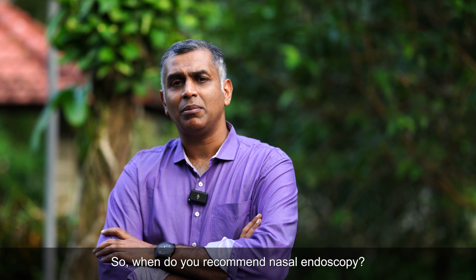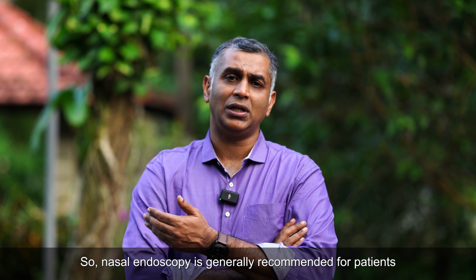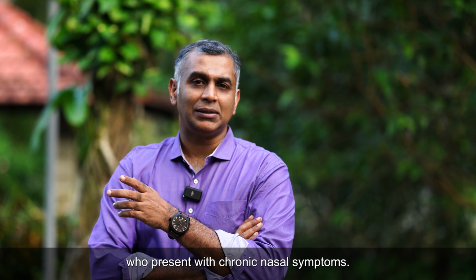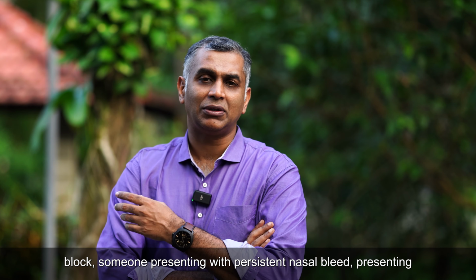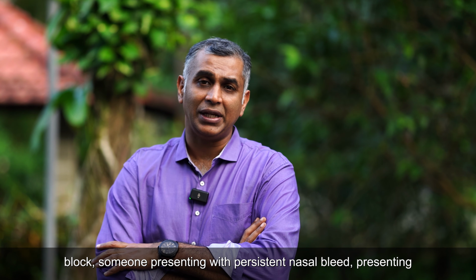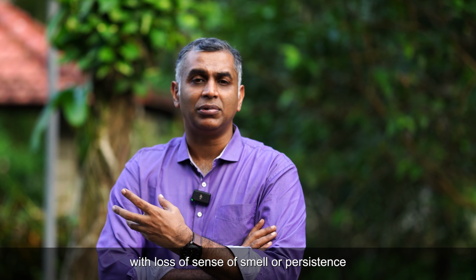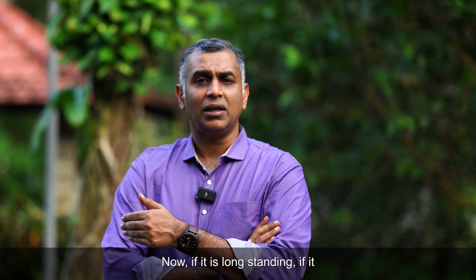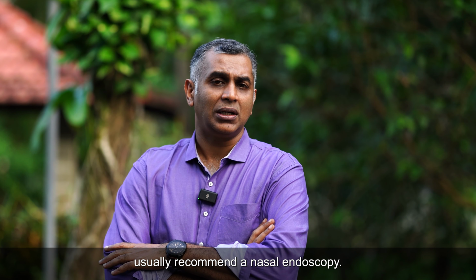So when do you recommend nasal endoscopy? Nasal endoscopy is generally recommended for patients who present with chronic nasal symptoms. For example, someone who presents with persistent nasal block, persistent nasal bleed, loss of sense of smell, or persistence of nasal discharge. Now, if it's long-standing, if it's chronic, in this subset of patients, we usually recommend a nasal endoscopy.